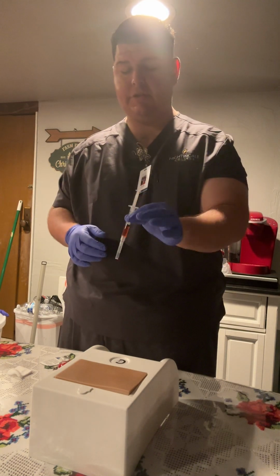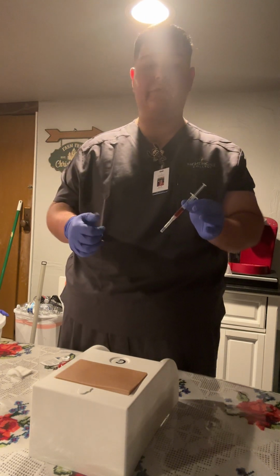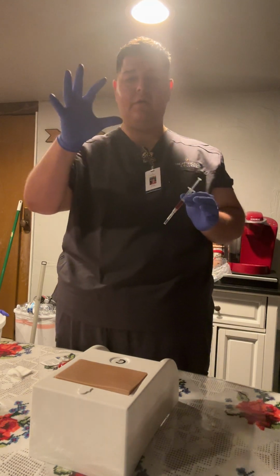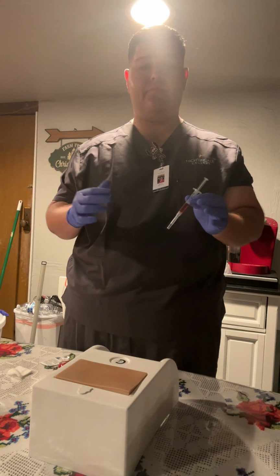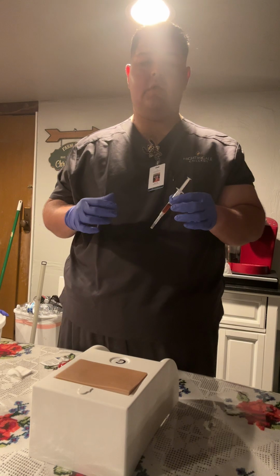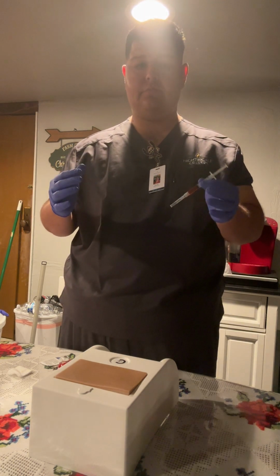I want to use my non-dominant hand to apply pressure to the skin so that I make it nice and tight, almost as if I was using the C method with my fingers to spread it without touching the injection site. I want to come to the skin at a 90-degree angle and inject. I'll use my 2 fingers on my non-dominant hand to stabilize the syringe.